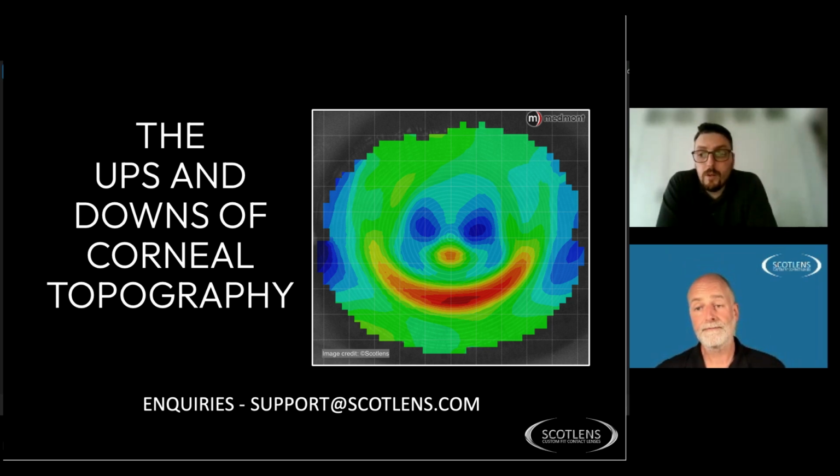Excellent. And last one, do you also use the Pentacam or ESP? Yes, we can. They're designed really for scleral topography. And so the ESP particularly is not great from the point of view of giving you reliable corneal information. So be very diligent if you're using an ESP to get corneal data, because look at the metrics, look at your K readings, look at the readouts you get. You want to have consistency between, say, three captures for each eye. The Pentacam is pretty reliable, but the ESP is not great from a point of view of corneal topography.